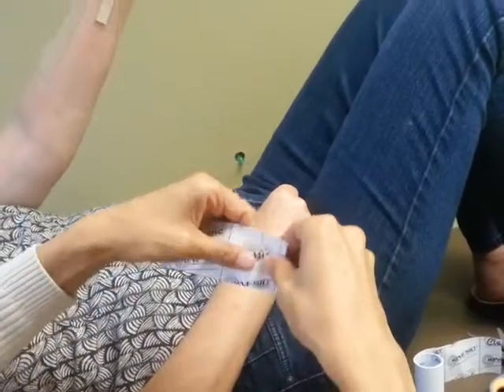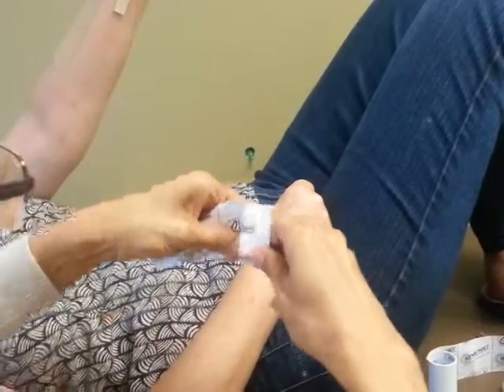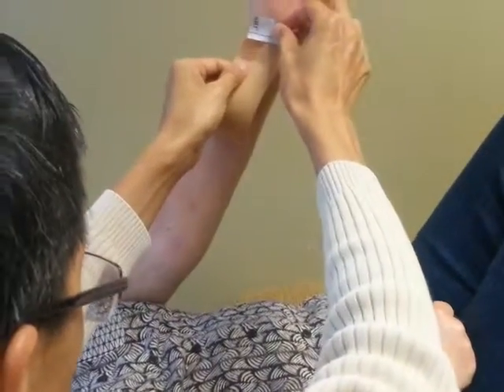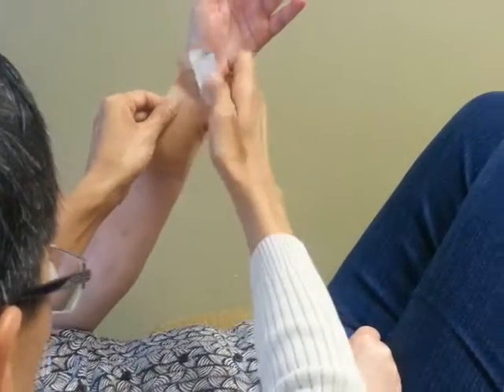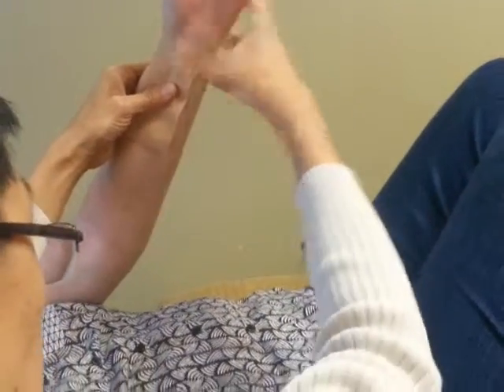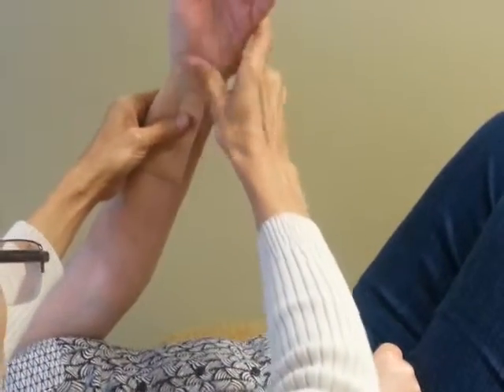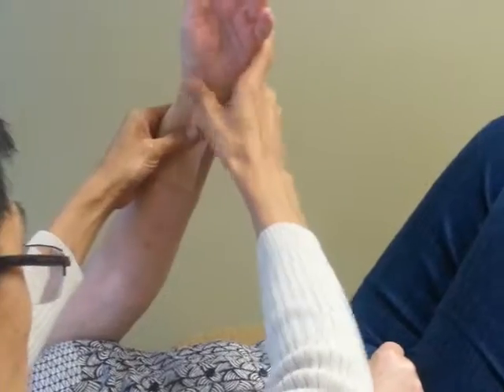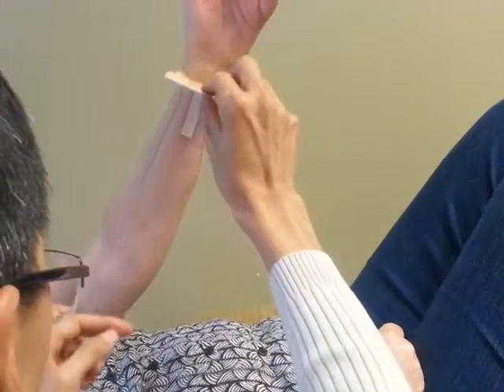When you tear it, you tear it about half an inch — that's going to be your anchor point. There's no tape usually directly on skin, but I'm going to tape it directly like that. You want to rub it away from the tape, because if you rub this way you can start peeling, and once you get your oils on there it doesn't stick as well. Heat from rubbing makes it stick better. So now you've got an anchor point, and when I lift it, it shouldn't lift off. If it lifts off, that means there's too much oil on the skin.